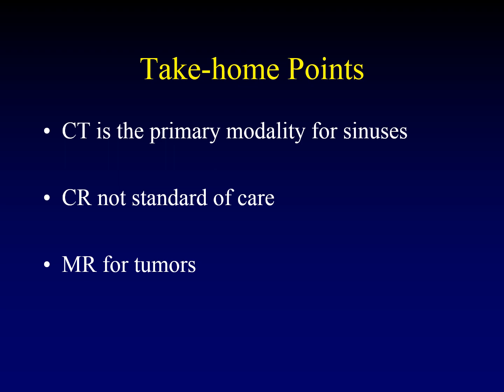So after our discussion of modalities and anatomy, I think the take-home points are that CT is the primary modality for the paranasal sinuses. Conventional radiographs are no longer standard of care, and we should strive to substitute CT. The CT is not a substantially greater dose when you use a low-dose technique, and it provides much more reliable information. Conventional radiographs are both non-sensitive and non-specific. MR has a few niche uses, in particular for infections and for tumors.